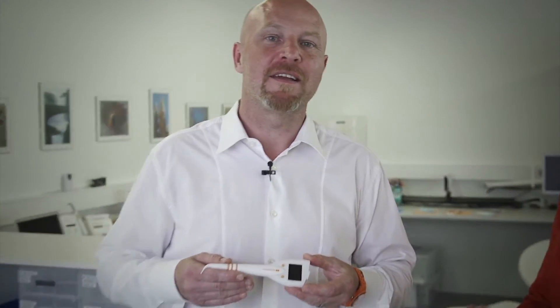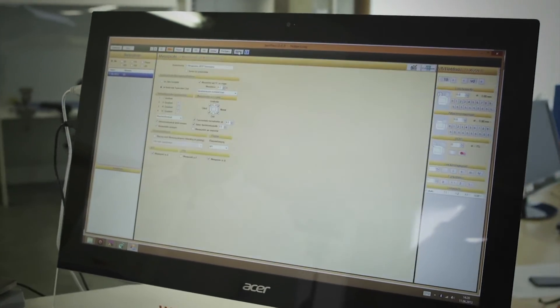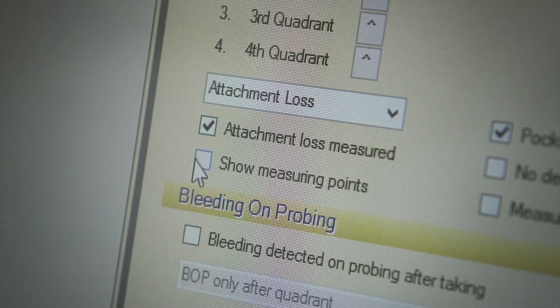With Paon, you get standardized measurement results even between different dentists or hygienists. That's why you can easily delegate the measurement. You can follow your usual measurement procedure — with four or six measurement points per tooth, with or without bleeding index — and you can set your personal measurement procedure in the software.